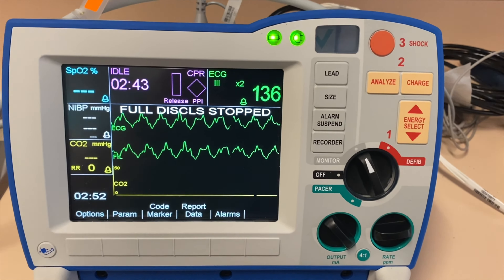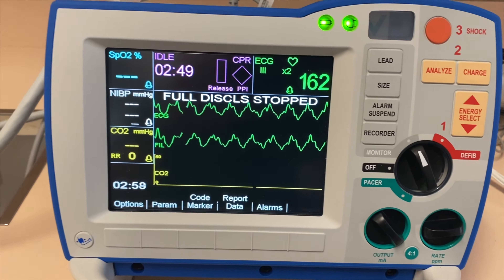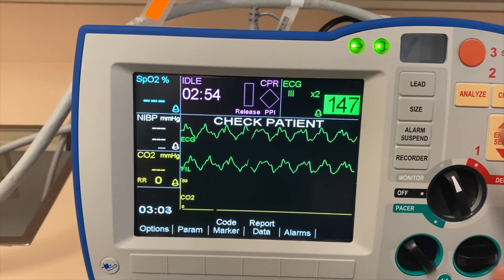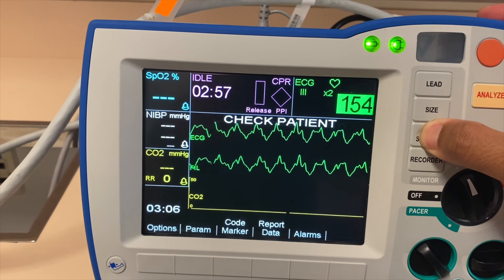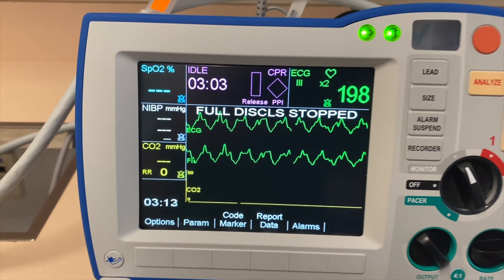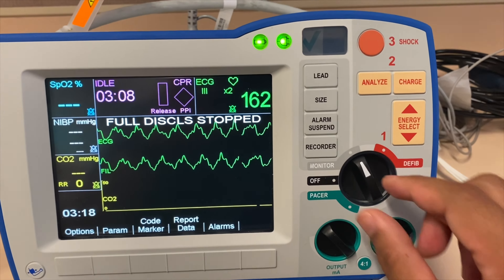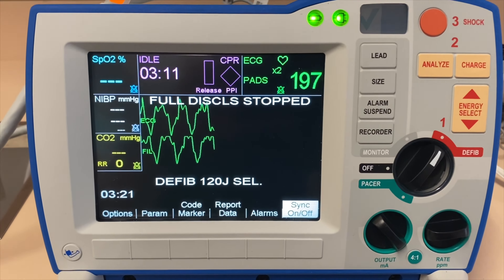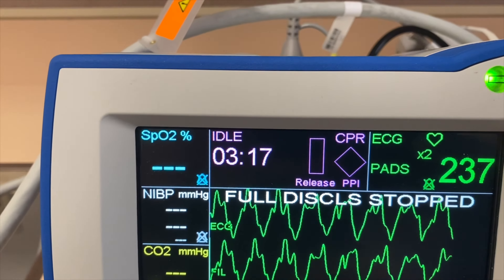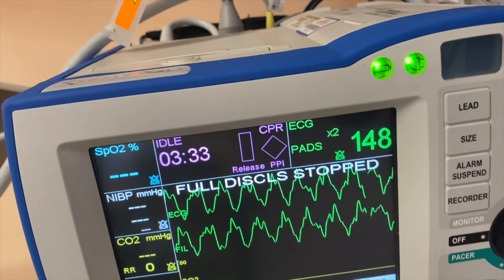Now let's talk about the defibrillation mode. The patient's rhythm is showing V-fib, and you see all the alarms are going off because our alarms are turned on. If I do want to suspend the alarm, I would press and hold until I would see all the X marks in my bells. The treatment for this will be defibrillation. I want to make sure that my knob is turned to defibrillation mode, and you want to make sure that you are doing correct CPR.